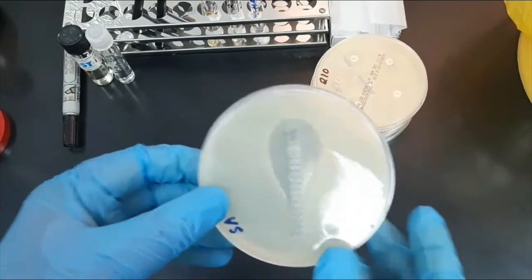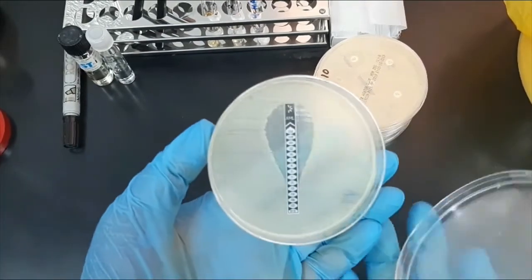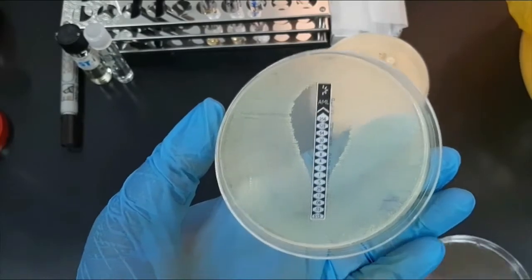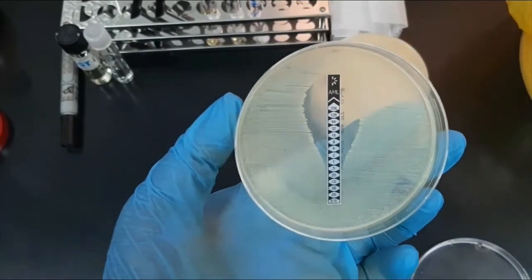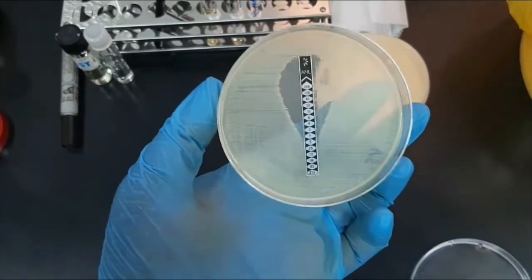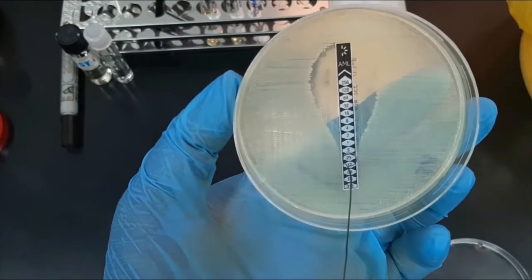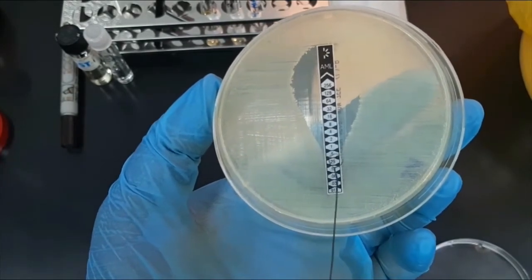After incubation, read the drop-shaped inhibition zone. Read the MIC value at the point where the ellipse intersects the side of the strip. Interpret the MIC reading following the standard guidelines.